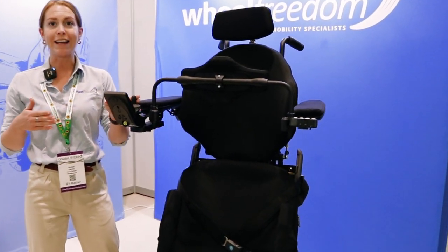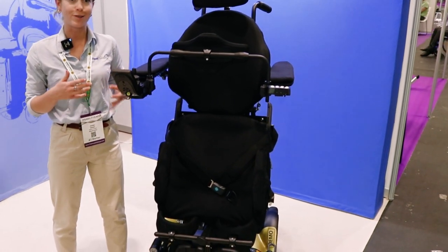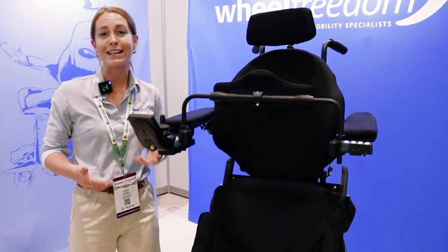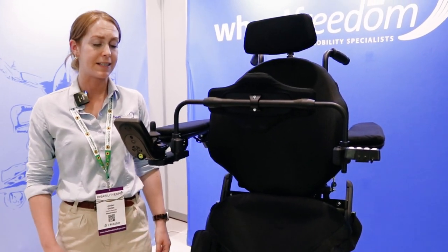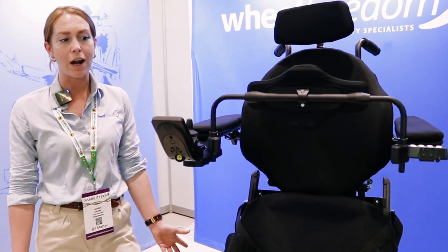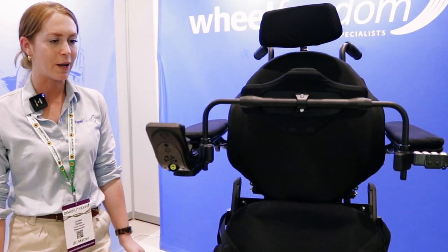Being at this height you can reach things from cupboards. I've got a young boy who's not long been using his standing chair and is able to use it in DT and his science classes to get up to the same desk height as his peers, which has been really quite life-changing for him because of the social inclusion he's now able to experience.